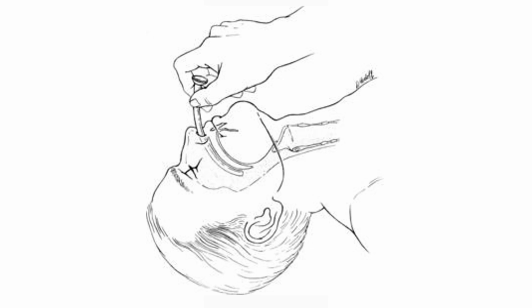Which way does the air go? Looks like it goes up that way, doesn't it? Well, if you try to put it up that way and you get clear fluid back, just take a little taste of it, and if it's sweet, you know you went in the wrong spot. Because you can do that. It actually goes straight back.